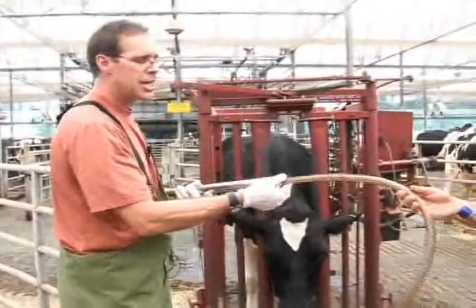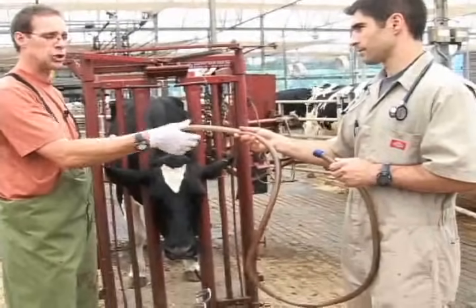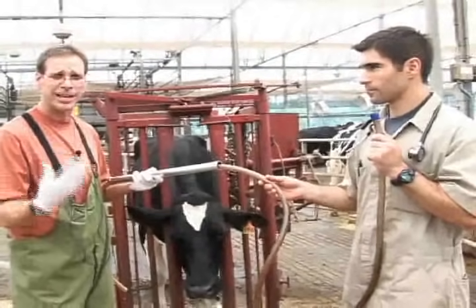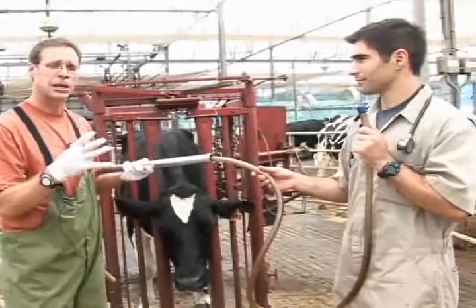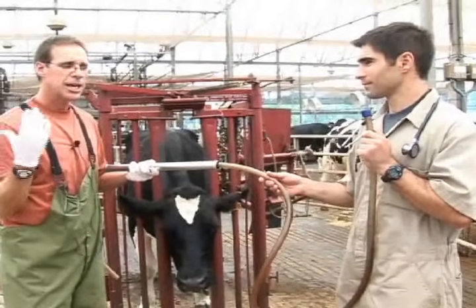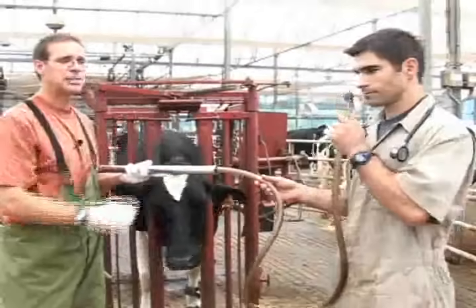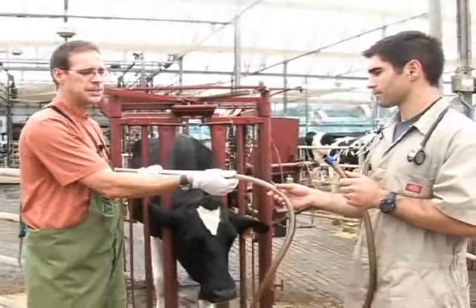Thirdly, once you've passed the tube fairly far down and feel that you're in the rumen, you will listen for air to rush back — not air from normal breathing or exhalation, but air from hitting the rumen gas pocket, which allows air to gurgle through and you can hear it very clearly. If you have an abnormal animal with a sour rumen, you can actually smell the contents as they come through the tube.